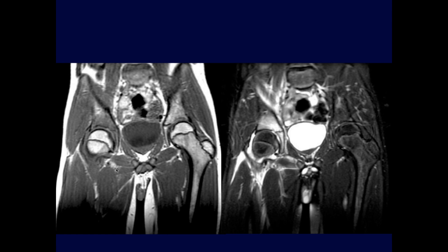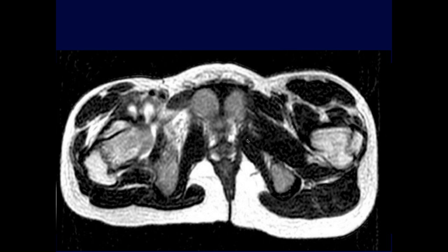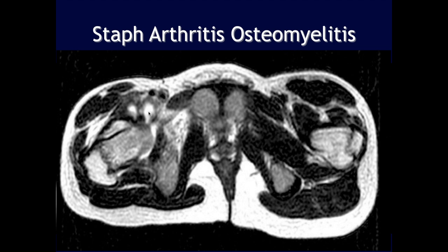Right hip pain in a young kid. There's abnormal signal in the superior acetabulum on STIR sequences — markedly hyperintense with low T1 signal. The cortex of the acetabulum looks intact and the femoral head appears fairly spared. There's a moderate joint effusion and what looks like an iliopsoas bursal effusion. In a child, joint effusion always raises concern for joint infection — and these are emergencies that must be diagnosed and treated immediately.